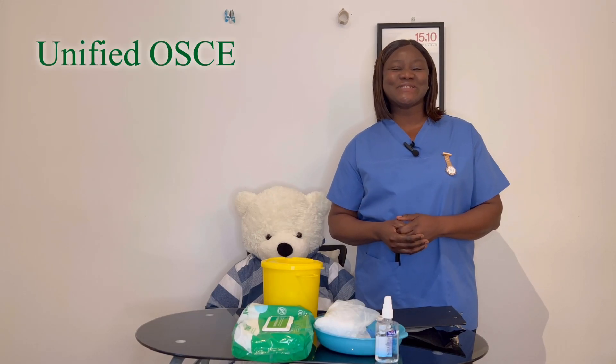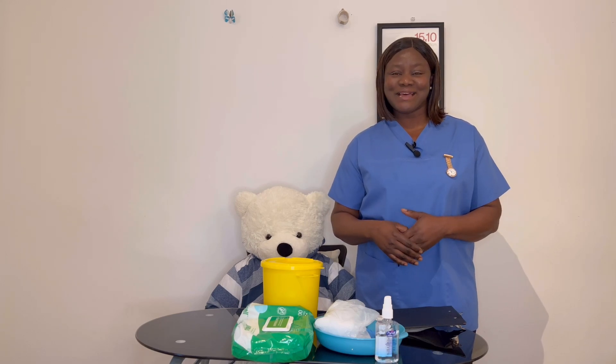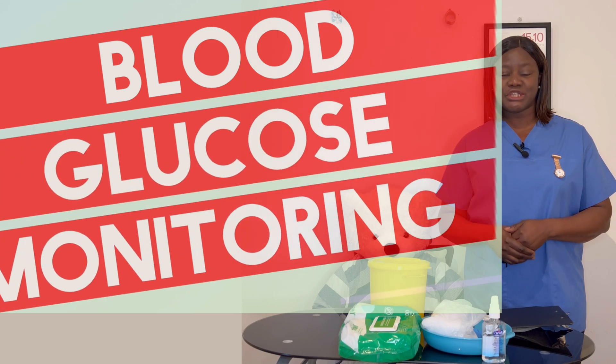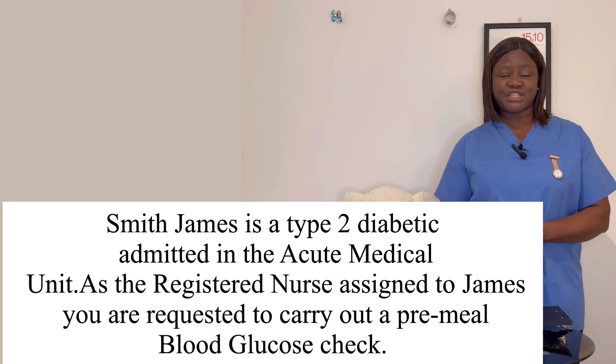Hello, welcome back to Unified OSCE. Your success is our delight. In this video, I'd like to take us through blood glucose monitoring. It is a practical hands-on skill in an OSCE station.